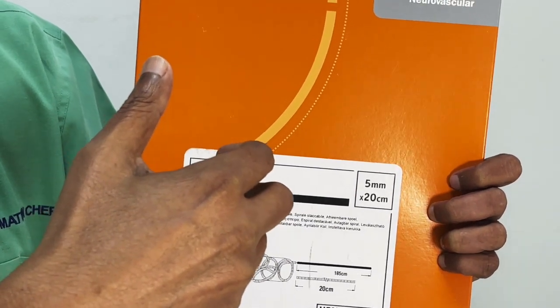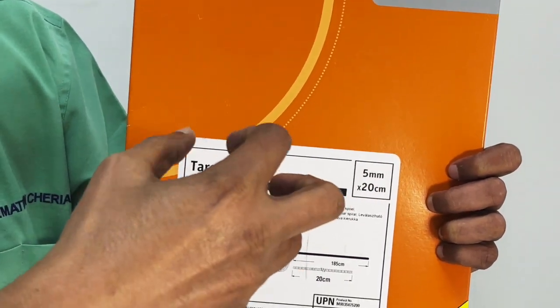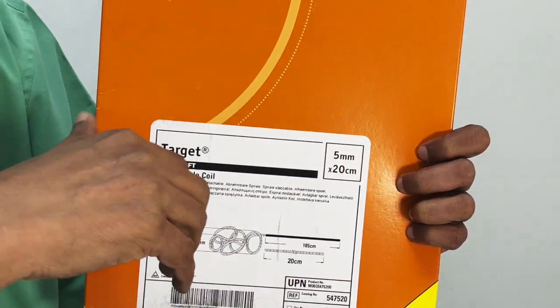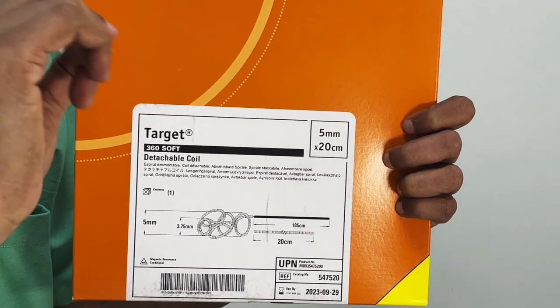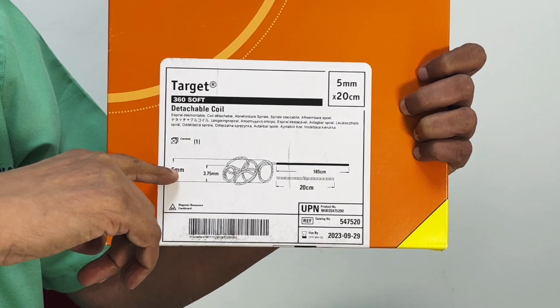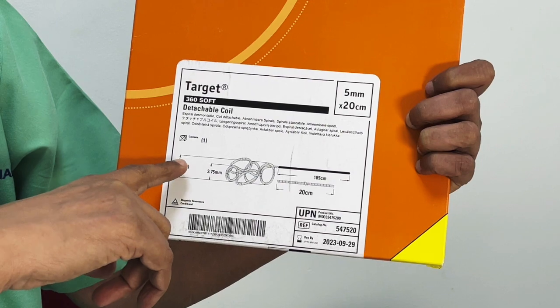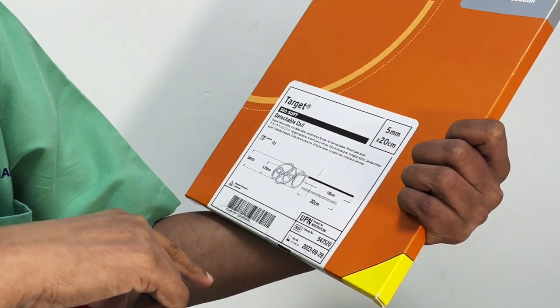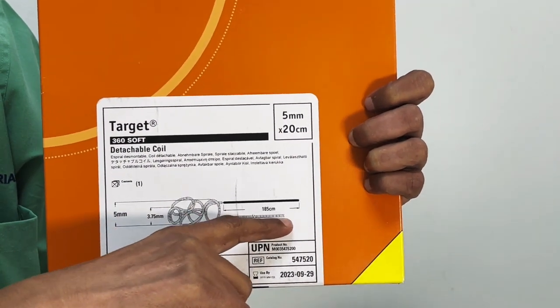So don't feel that, I want to be very safe, I've got a 5 mm aneurysm, so all of them are ultra soft. Compaction is more because it is a much softer coil. So today we have a lot of soft coils. Remember, the property of the coil is also the property of the mandrel, because the mandrel has to be equally soft. So you have a coil which is 5 millimeters in diameter, and let me have a look. I'm getting confused. Oh, it's 5 and 20 centimeters in length, right? That's a very large one.